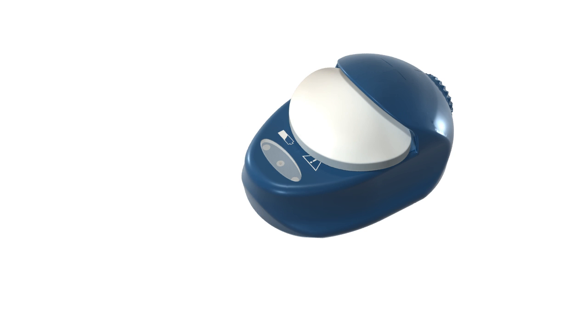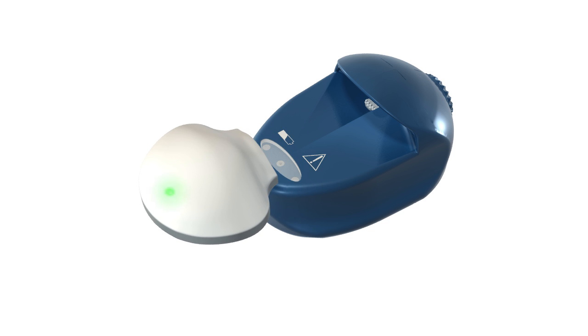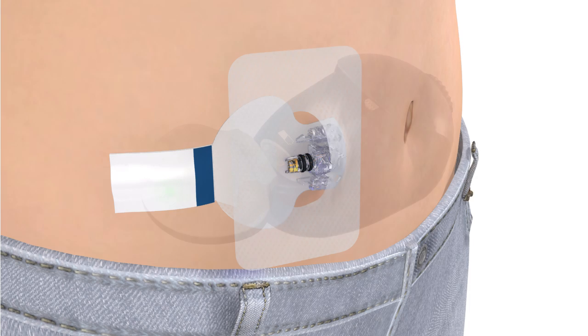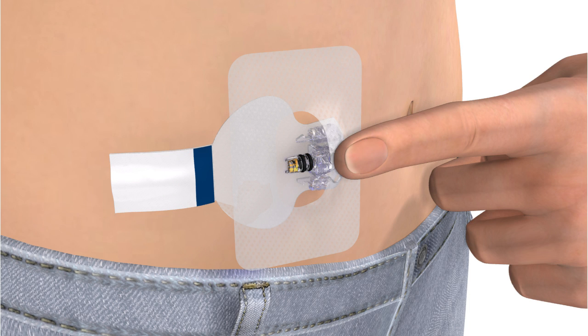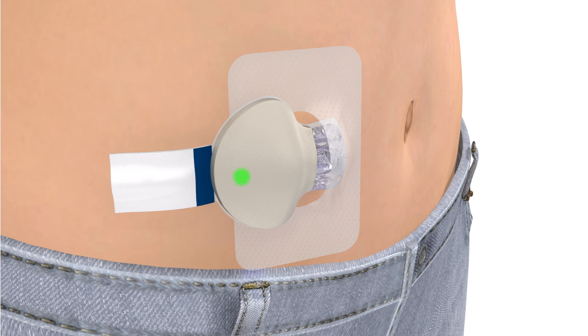To connect the transmitter to your sensor, remove your transmitter from the charger and watch for the green light to flash. With one hand hold the sensor in place. Hold the transmitter with your other hand and push it onto the sensor. It will click when it is connected. The green light on the transmitter will start flashing within 20 seconds. It will flash for a few seconds and then turn off.